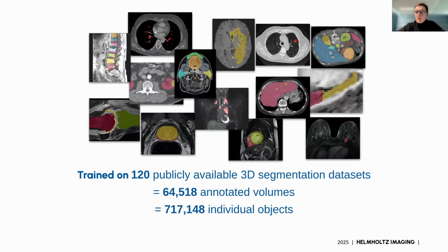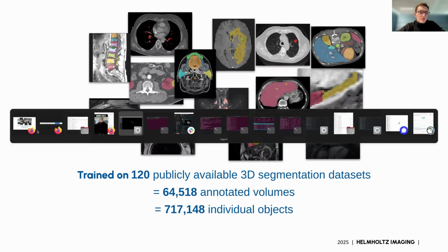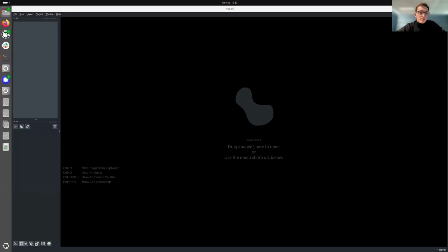Basically anything that is interesting to you and that is publicly available and has 3D segmentations. It doesn't really matter what modality it is. Could be anything, microscopy, or medical related. The model should just learn to adapt to a natural 3D setting.